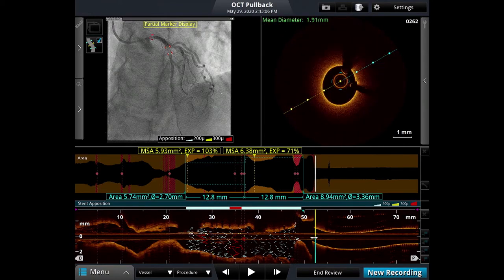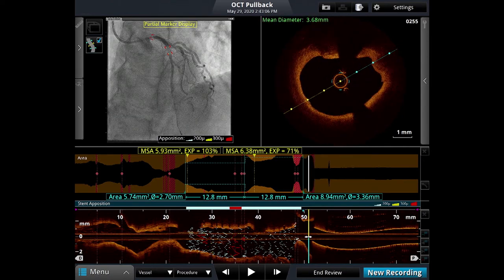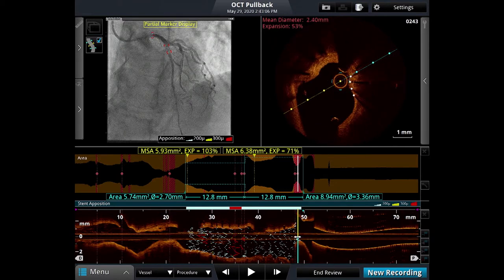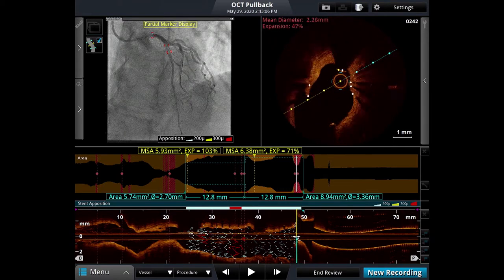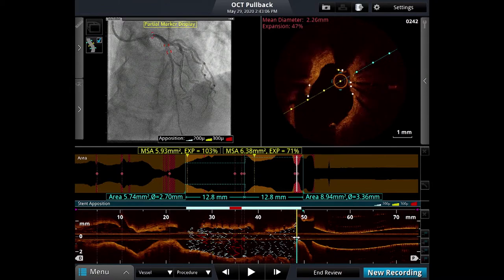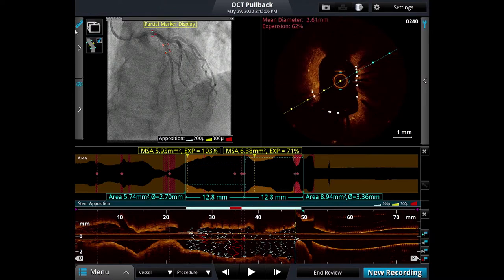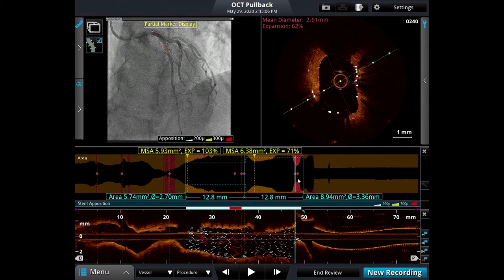We can go back to the proximal edge and size. This stent was a 3.5, probably post-dilated to 3.5 to 4.0. Here it measures at 3.27 along the longest axis. Based on imaging, if that were a fresh lesion we would have picked a 3.5 millimeter stent — which is what was placed a year ago. So that appears to be correct sizing, even though imaging wasn't used last time.